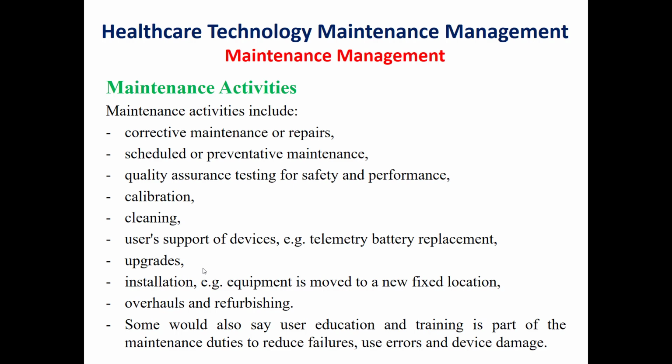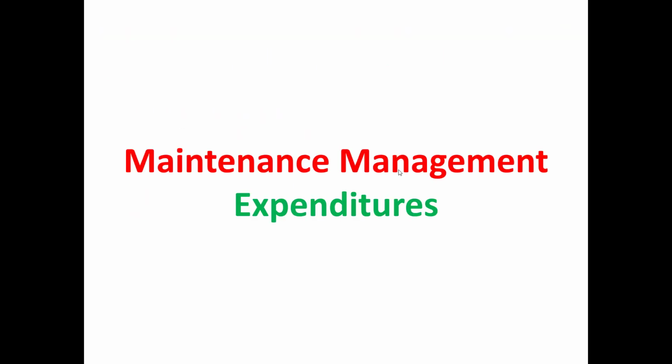installation in the case of the transfer of the device from one location to another, the overhauls and refurbishing, and finally, sometimes the user education and training is considered as a part of maintenance duties. The reason behind this is to reduce the failures, user errors, and device damage.